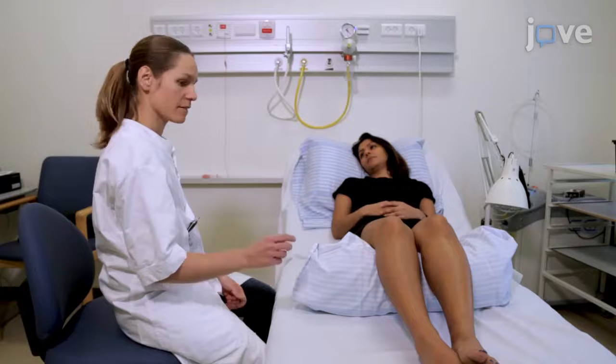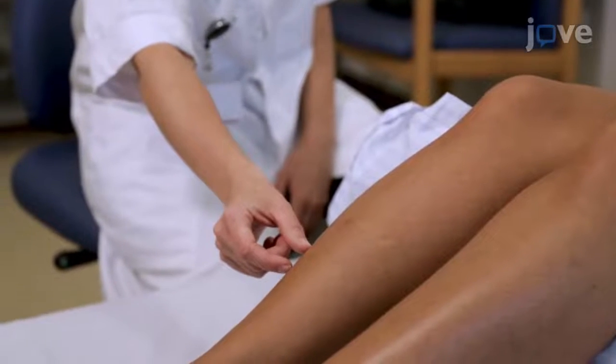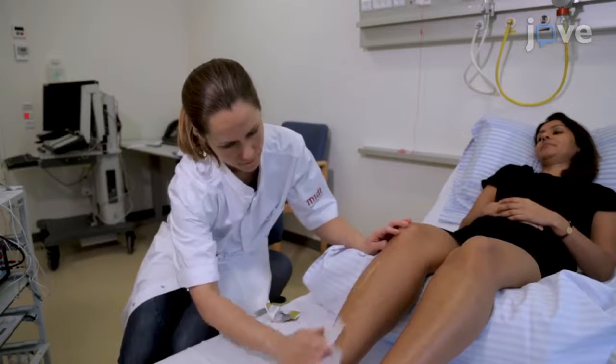Since there are no risks and only slight discomfort from this examination, we recommend that you practice on healthy subjects before examining patients. This technique is completely harmless as long as you follow basic instructions — remember to clean with alcohol before needle insertion and ensure there are no contraindications such as hemophilia or blood thinning treatment.